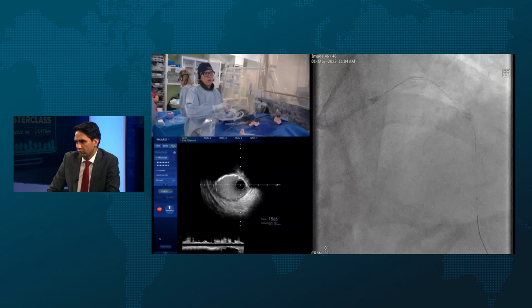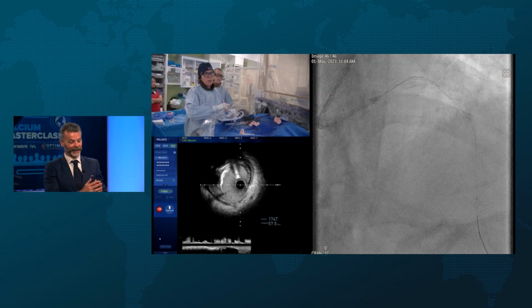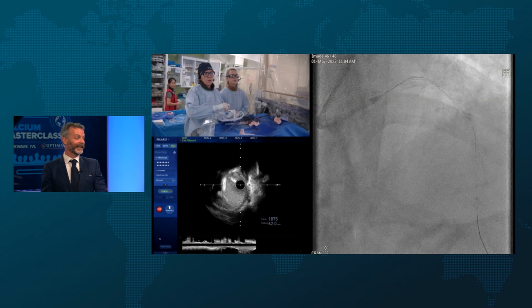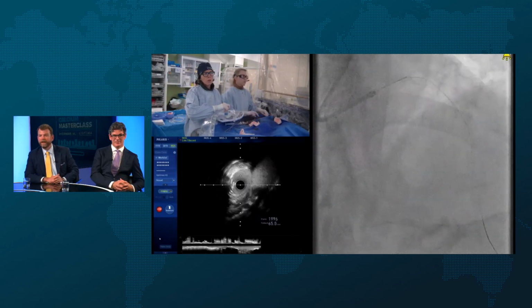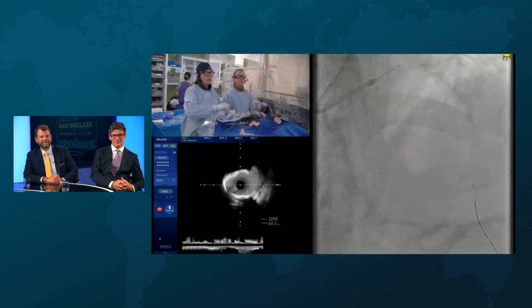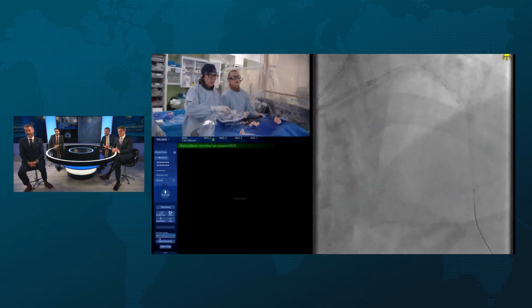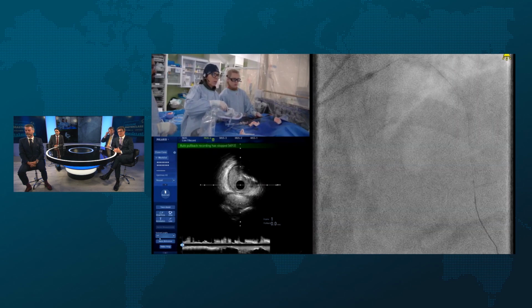What I think is interesting is a few years ago, we'd all been focusing on the concentric calcium, the proximal vessel, and ignoring everything else because, what are we going to do? Let's pretend it's not there. No, I got a stent in, so we're fine. We've modified the ostium nicely. I think it's all nicely modified. You actually got a landing zone as well, which is ideal.